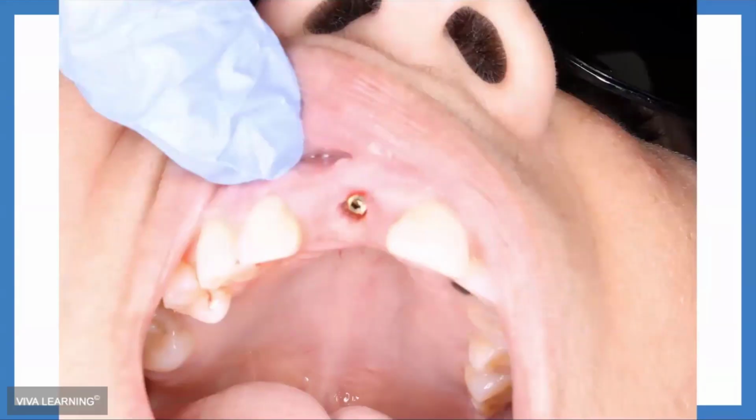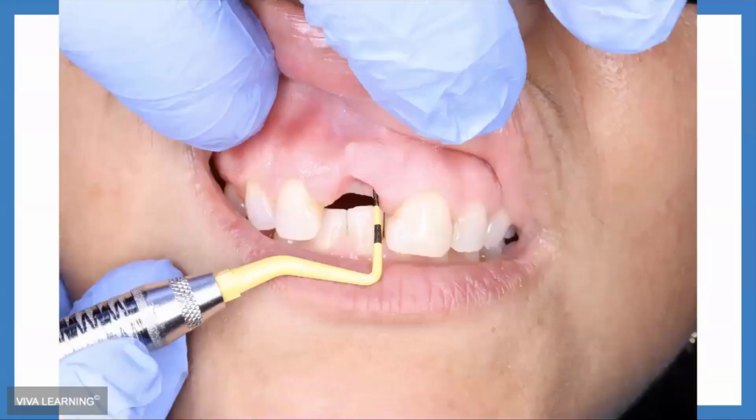We uncovered the implant with the same guide that we used to place the implant. So just minimally invasive there. I'm redoing my measurements here because I don't like to glue. You guys keep in mind, I'm making my implant crown ahead of time. So this patient is leaving from implant surgery, and I'm already milling their crown out.